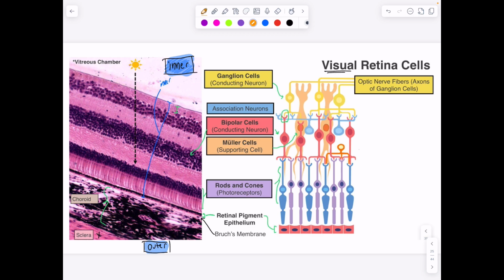The visual retina, the retina, is the layer of the eye that does all of the light sensing. The idea is that light is coming in, and then it hits this more bottom layer, the outermost, so this is inner, this is outer, the outermost nuclear layer, and the part below it. This is the nucleus of the rods and the cones, and the rods are doing black and white, cones are doing color. In the nucleus of the rods and the cones, you have organelles, and then you have the pigments of the rods and the cones overall. All right, so nucleus, organelles, pigments.